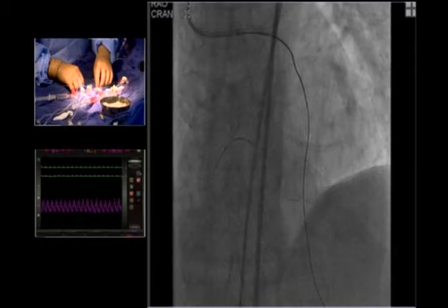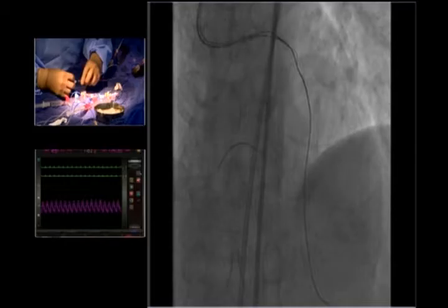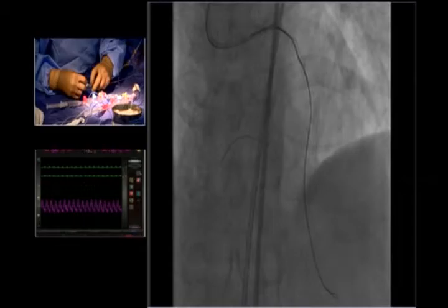Yes. But I cannot advance the Caravel. No, smaller. I want to see everything. No, magnification reduced. The tip and the catheter both. Okay. Yeah. Okay, I will try to pull back the wire. It's easy. So then I try to remove the Tornus again.